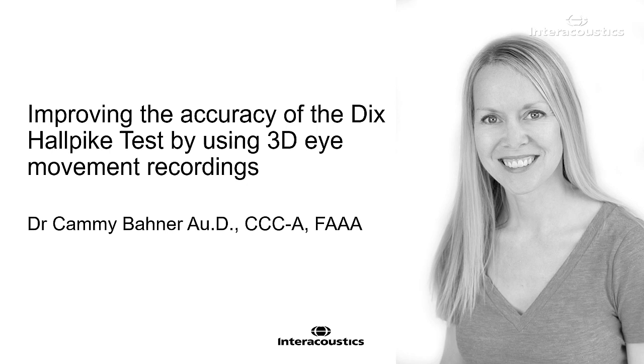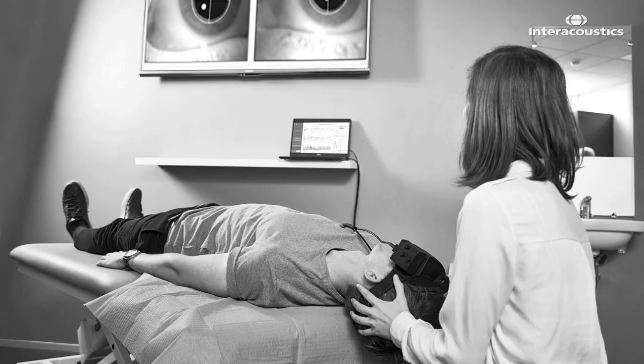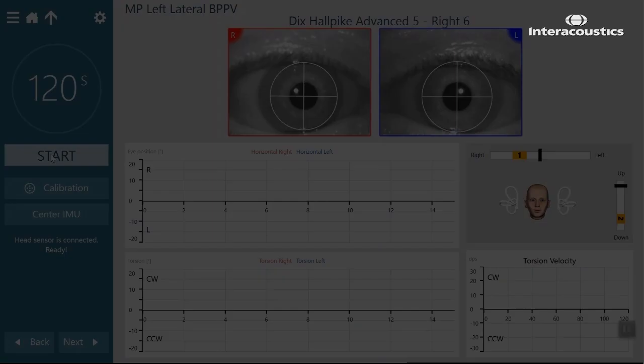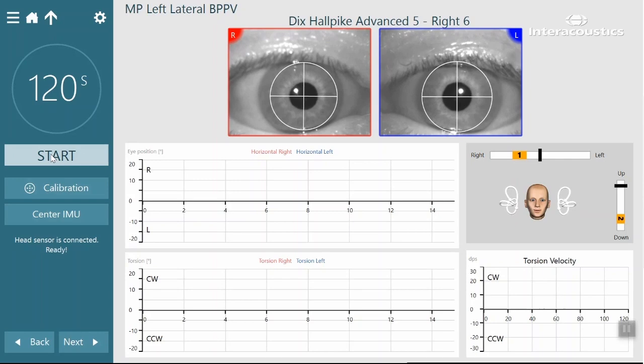The third generation of Visualize addresses these problems. The Advanced Dix-Hallpike test uses an inertial measurement unit, or head sensor, that attaches to the goggles and can detect patient head position in any plane.